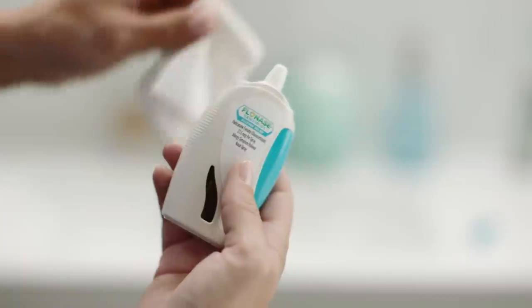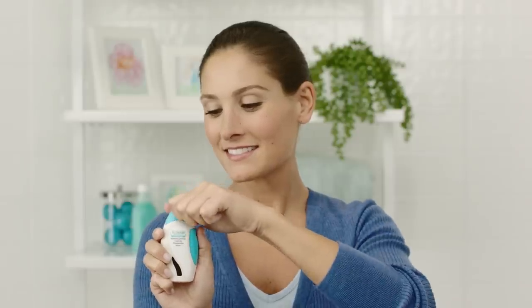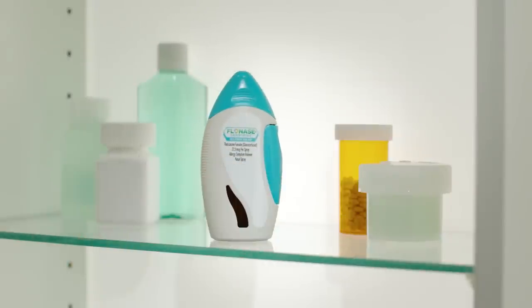To clean your Flonase Sensimist, simply wipe the spray nozzle dry with a clean tissue. Replace the cap and store until you're ready for your next dose. Remember, when used daily, Flonase Sensimist Allergy Relief continues to provide powerful relief 24 hours a day.